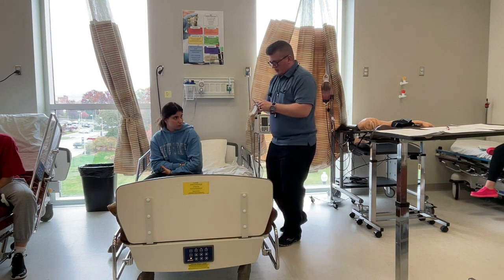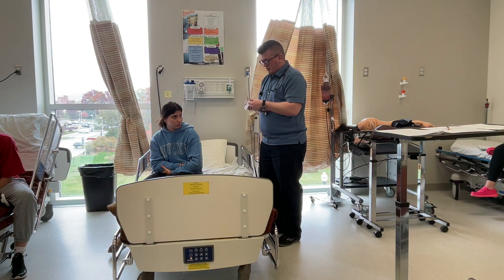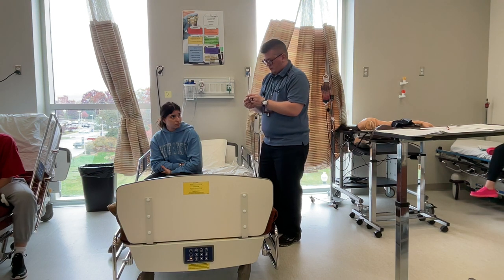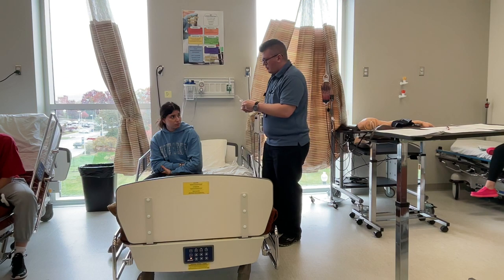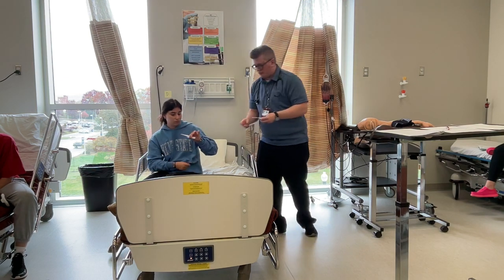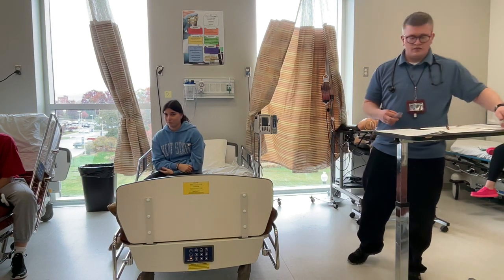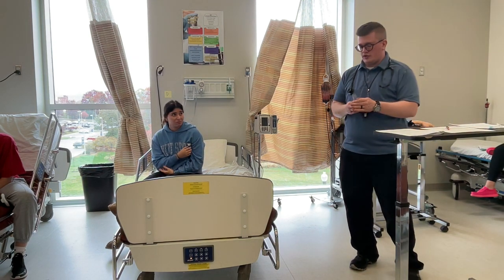I'm going to take your temperature. This is just a probe cover. I'm going to put that right underneath your armpit. Under your shirt.